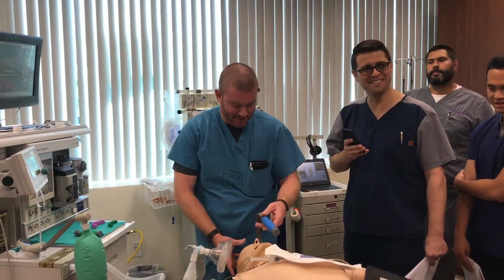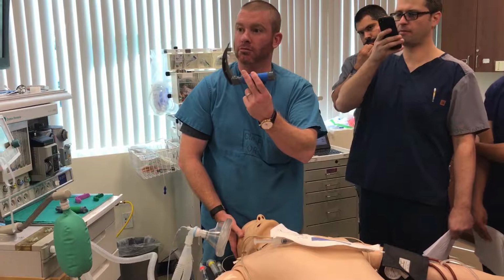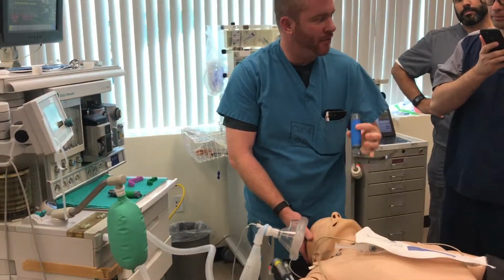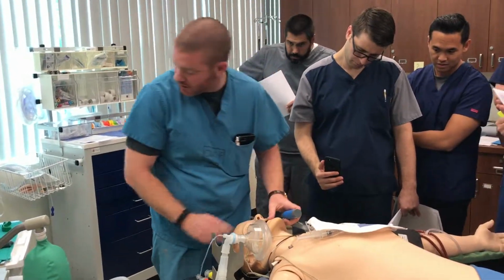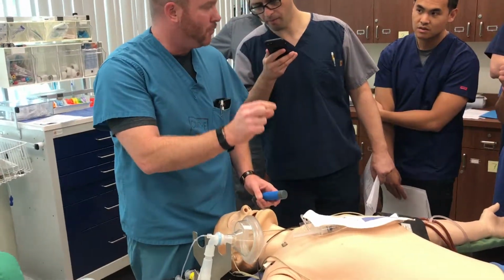Okay, that's fine. So when we grab the laryngoscope, this can be brutal, right? This could kill somebody. So don't hold it like this is what I'm trying to get at. Be very fine precision with this. This is going to be a scissor method. You'll come in there and hit the teeth. You see this in his teeth? No, we'll leave his teeth out. But right, a scissor method, you're going to get back in the molars.